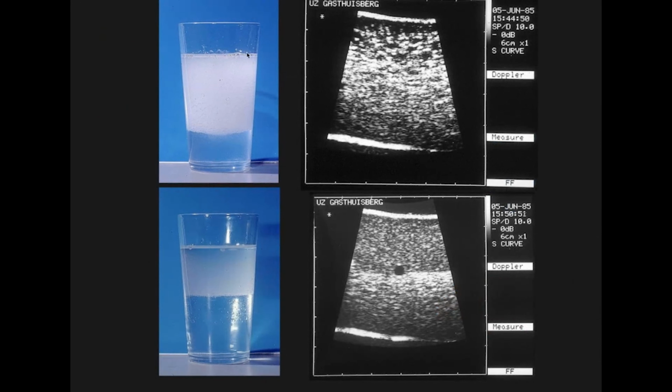And here is an example. If we create gas bubbles, it can be that they're dedicated or just really temporary gas bubbles. That's not so important now, but what we can see is that while water would be transparent, we can really see some reflections in water. For example, we can check a boundary of a layer of contrast with a layer of water, and we can generate extra reflections there in order to get more information.